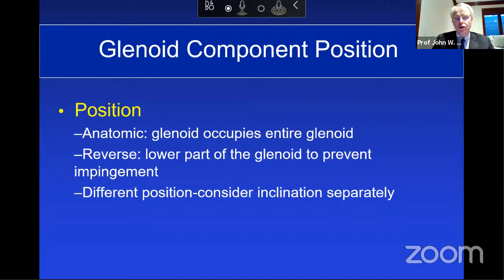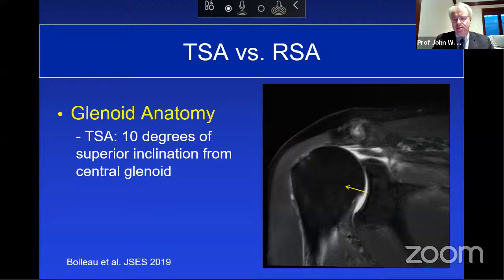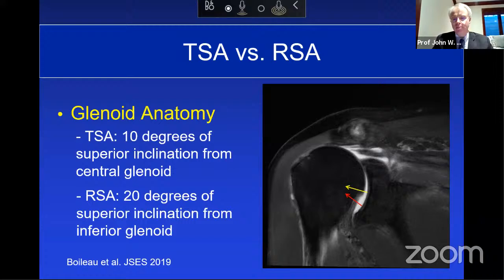I think one of the things we've learned now is that when we do an anatomic total shoulder, the glenoid component occupies the entire glenoid. But when we do a reverse shoulder, the lower part of the glenoid is where we place the component to prevent impingement. And I think we need to think about the inclination separately. This is the paper by Pascal Boileau in April 2019 that I think really helps change our thinking on this. From the central part of the glenoid, there's 10 degrees of superior tilt. But when you go to the bottom part of the glenoid where we place the base plate, there are 20 degrees of superior inclination. And as Professor Oh noted, we have to correct this in all our reverse cases.